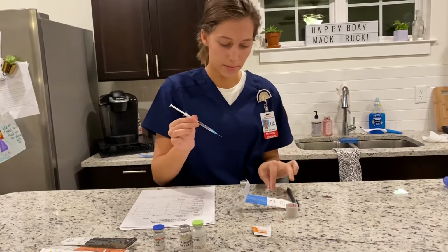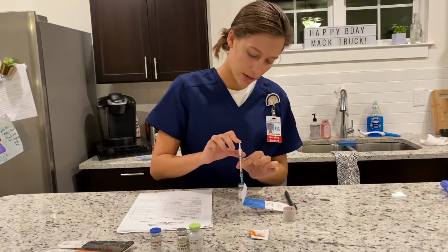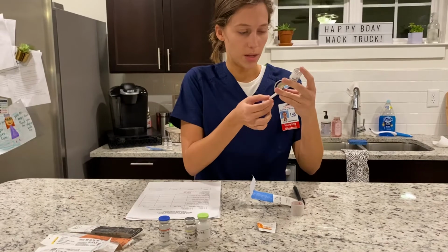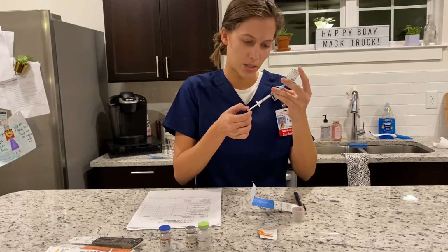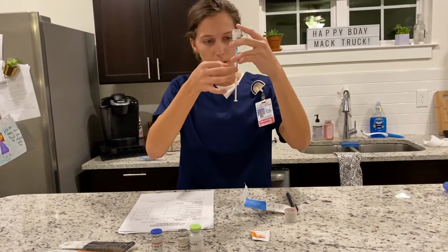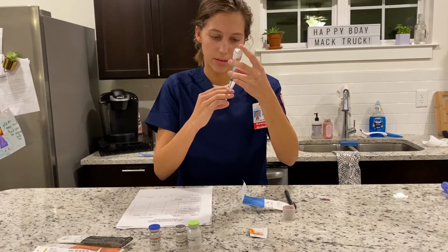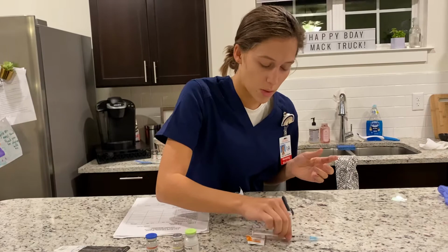I'm going to take the cap off, set it to the side, put it in the vial, release the air, and then I'm going to pull the syringe back and pull the medicine into the syringe. I'm going to get a little more than 0.5. Tap it, make sure there's no bubbles in it. Then I'm going to release it to 0.5. Then I'm going to cap it using the scoop method.